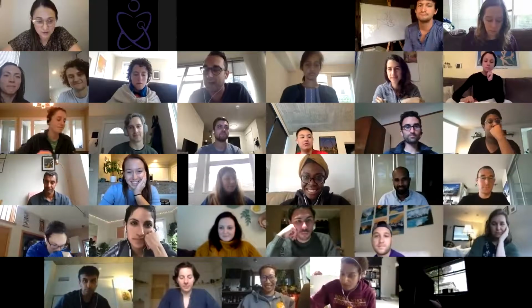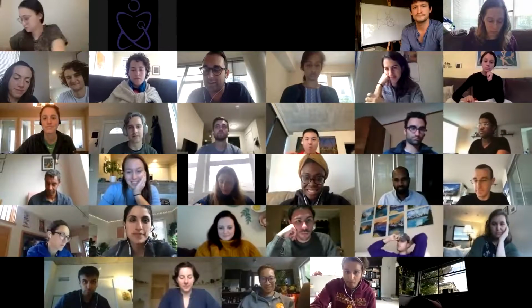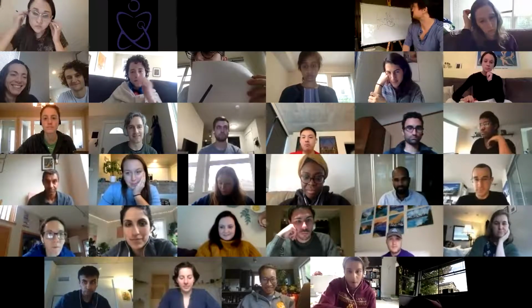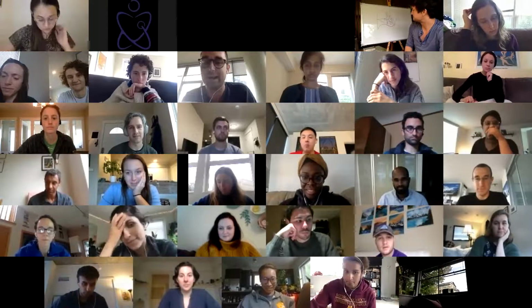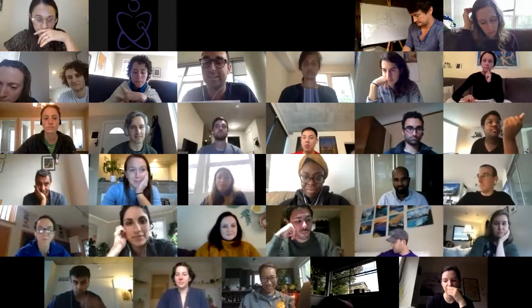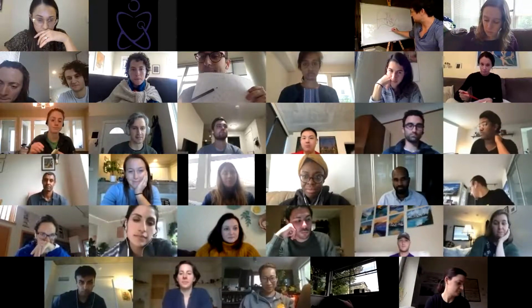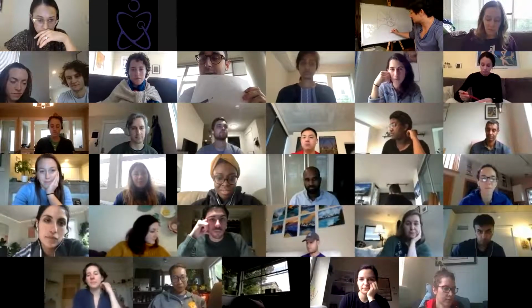I usually start with the alphabet. Yeah, the alphabet's a good place to start. So A, B, C, D, E. I look at the airway first. So I start by looking at the trachea and seeing if it's, well, I guess I should probably say that I should start by making sure I know if I'm looking at a PA or AP, and what the penetration and quality of the image is. Great point. Then after that, I would take a look at the airway, see if it's tortuous or if it seems straight in midline, and take a look at where the carina is.